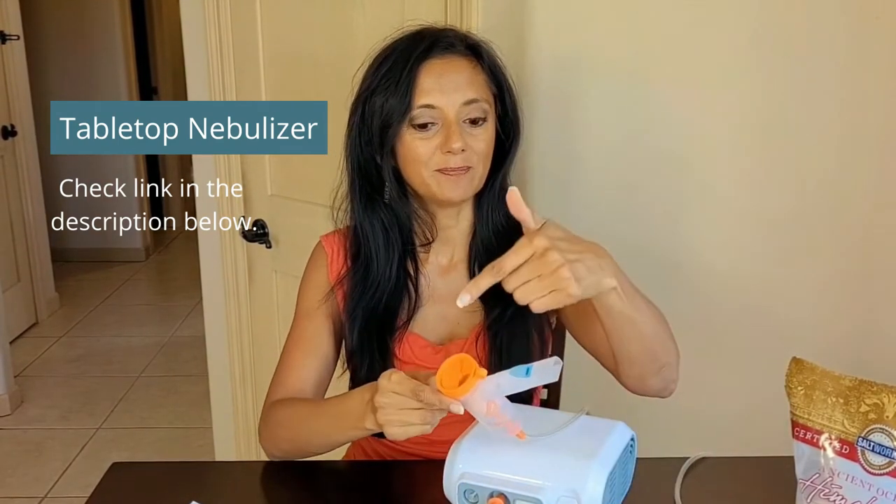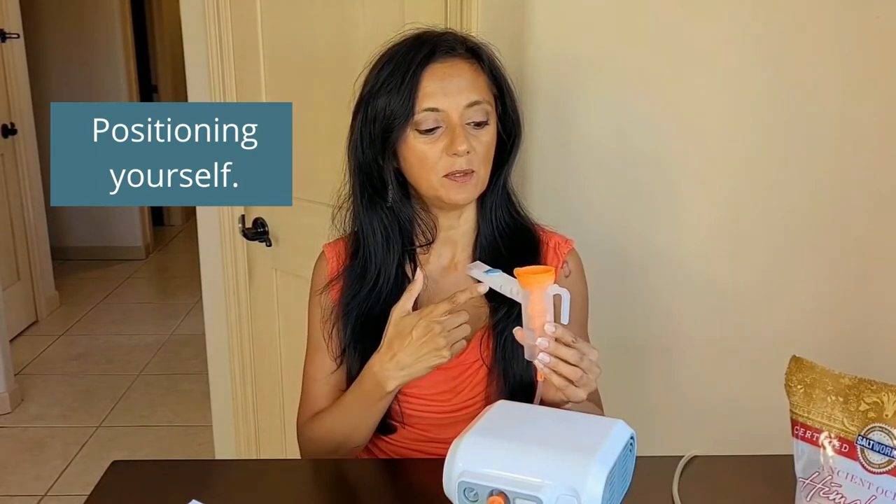Don't put it down because your medicine or saline solution will spill out. A few tips when doing nebulizer treatment: sit up nice and tall, make sure you're not slouching, not leaning back. You want the treatment to go all the way down into your lungs, so keep yourself sitting up nice and tall.